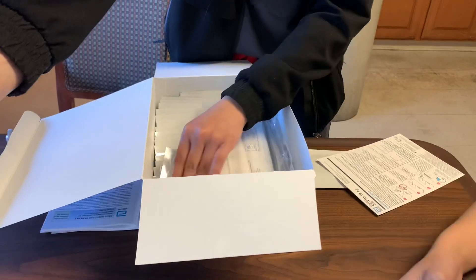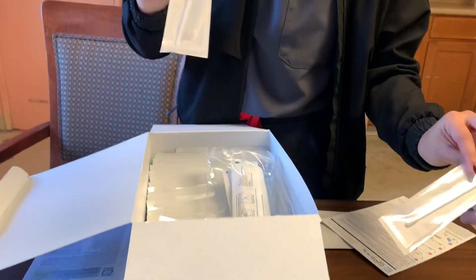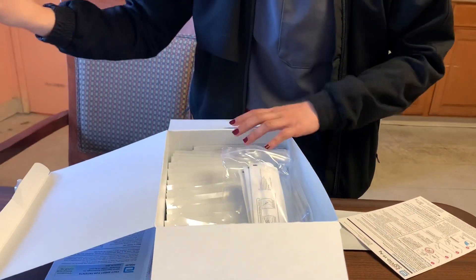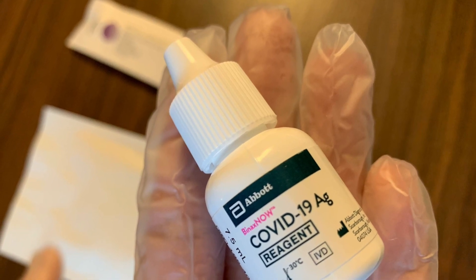So those are the AG card and nasal swabs. Unfortunately, the box only came with one reagent, so make sure you put it in a safe place.